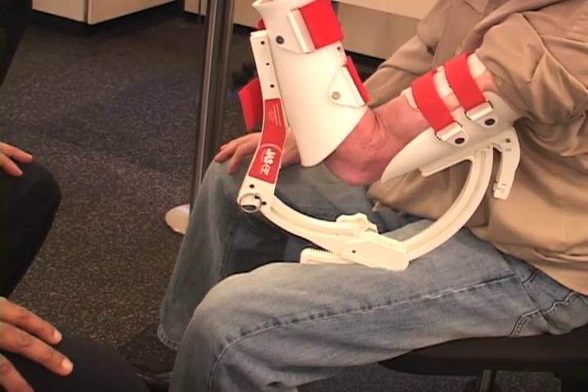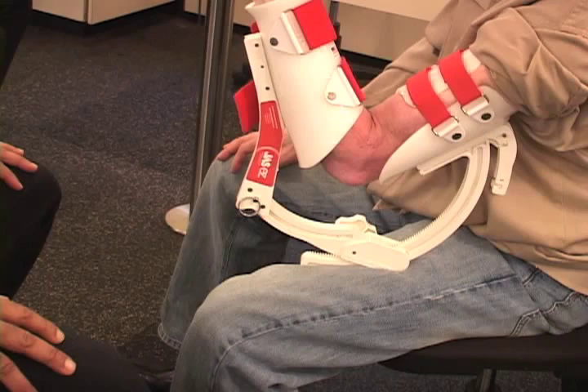He would do this for 30 minutes, three to four times a day. This device works very well because it allows a patient to regain motion with just 30-minute increments throughout the day, and they don't have to sit around and exercise all day long.